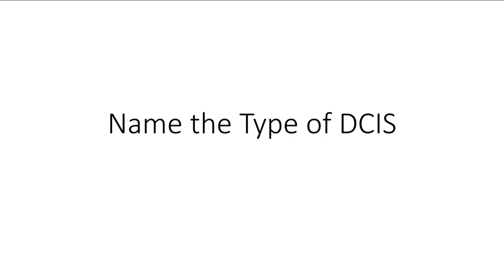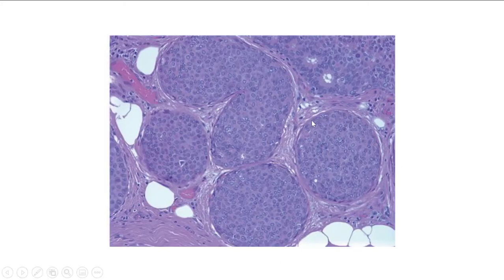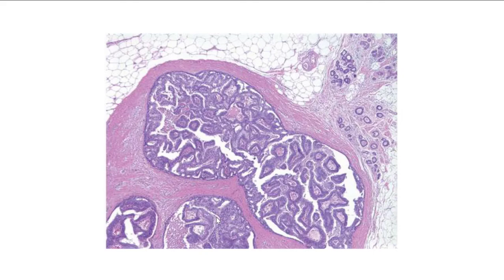Let's go through examples of DCIS subtypes. The cribriform type shows prominent cribriform architecture. The solid type is a uniform proliferation of atypical cells within the lumen lacking any cribriform architecture. The papillary type fills the lumen and, even at low magnification, you can make out fibrovascular cores. It has a rounded, non-infiltrative border with no desmoplasia.